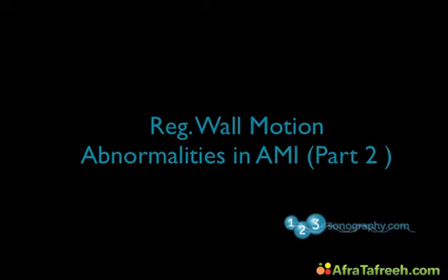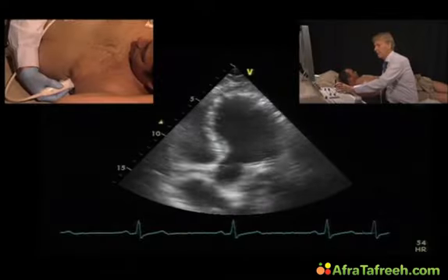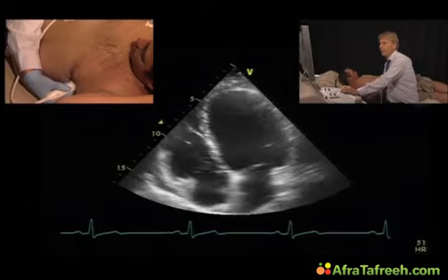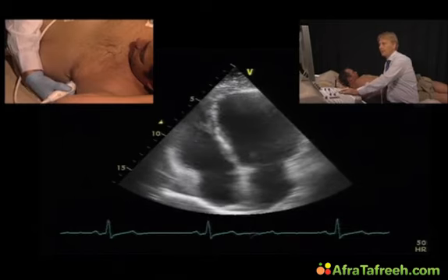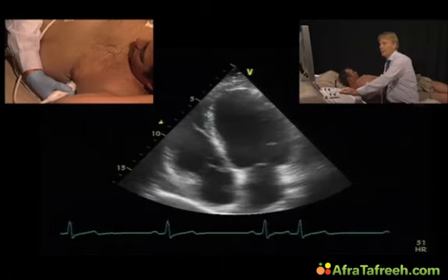Next, we'll take a look at the apical views of this patient, and keep in mind, always correlate the parasternal with the apical views. Let's take a look at the apical views. This is the four-chamber view, and let's focus on the various segments, and you will appreciate that the distal septum here and the apex has a wall motion abnormality.